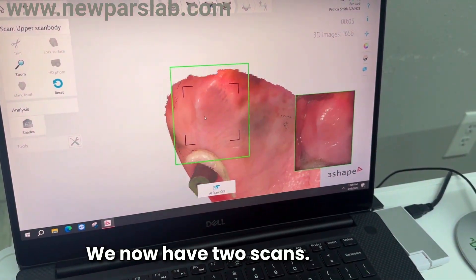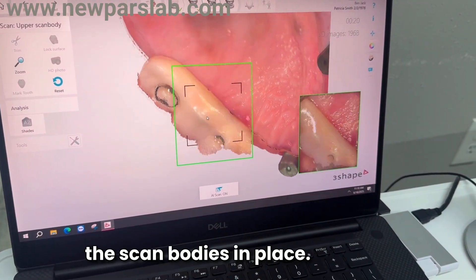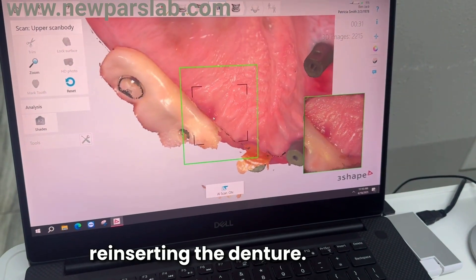Reinsert the temporary denture and ensure it is fully seated and properly positioned. For the upper jaw, we now have two scans: the pre-op scan taken with the scan bodies in place, and the jaw scan taken after reinserting the denture.